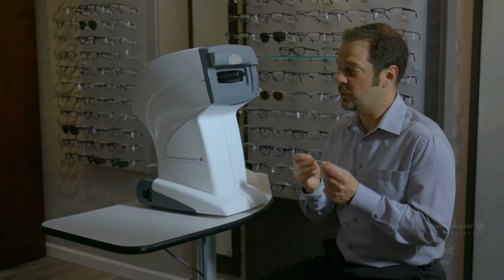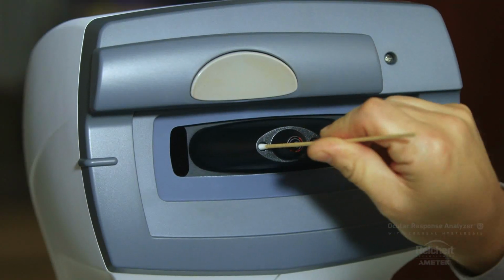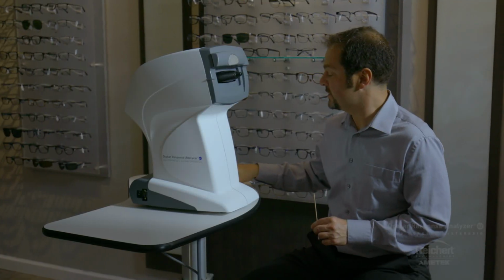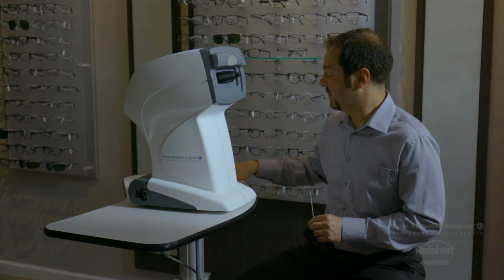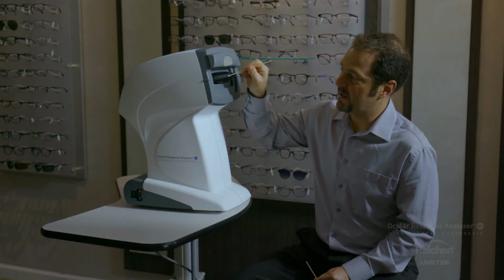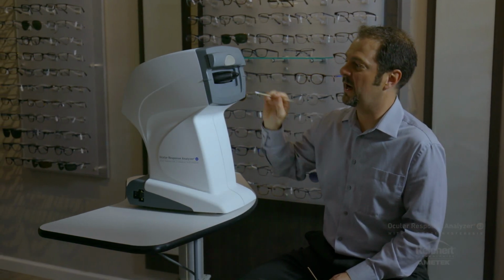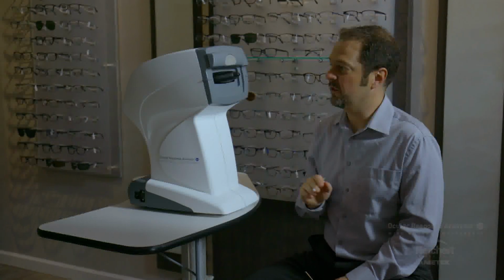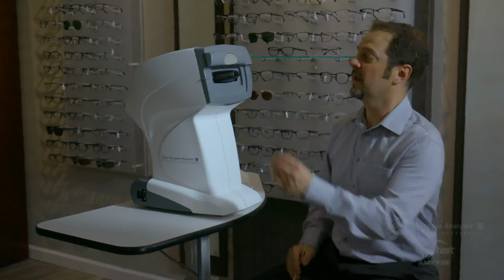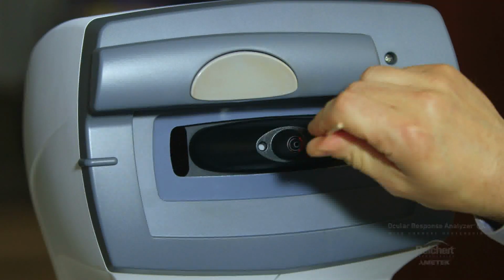Then when it's time to clean the applanation detection windows, you're going to take your cotton swab, you're going to moisten this with some alcohol, and you're going to go right inside there and just move it around, roll it back and forth, and make sure you get everything off of that glass. I use a second dry cotton swab then to dry the surface and make sure again that there's no residue or haze. These are very important windows. This is where the signal comes off of the eye, so you want to look in there with a pen light or a cell phone light and make sure that those surfaces are clean and lint free. Then you're going to go ahead and do that on the other window over here, same procedure.